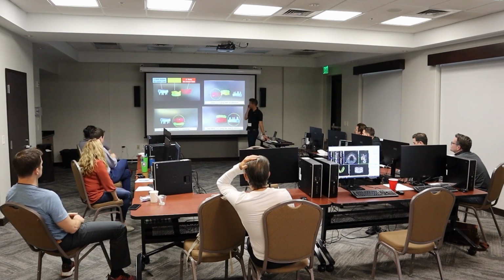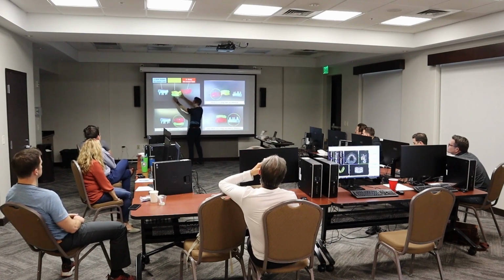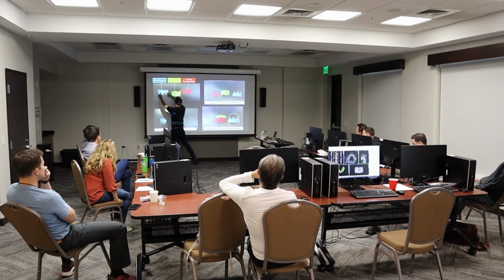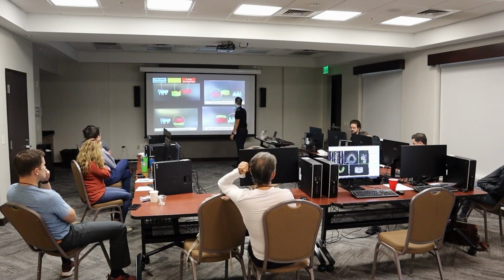And the reason is because we're going to take these 3 things and we're going to marry them all together. So you got your bite, you got your stone base here, and your stone base here. The important thing is the commonality points are in the stone base on this one and that one. And that's how you're going to bring everything together.